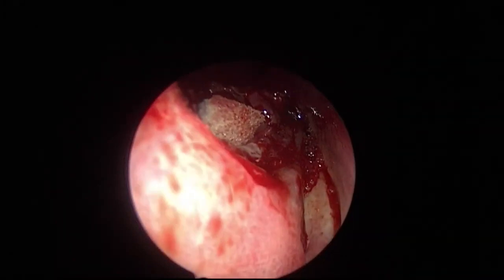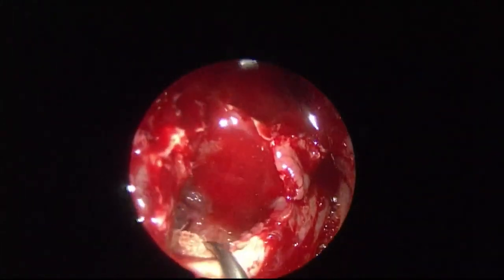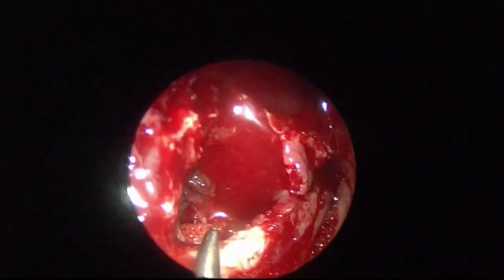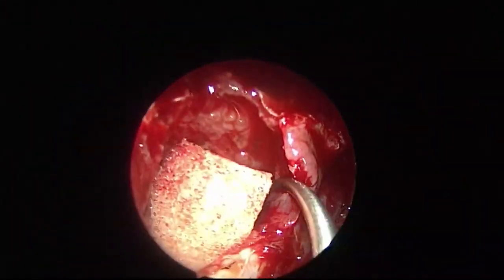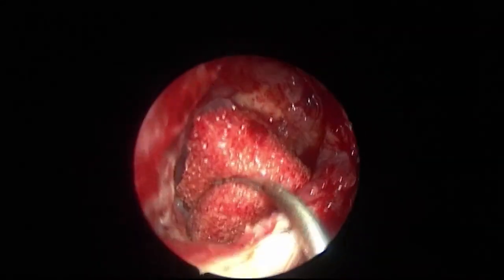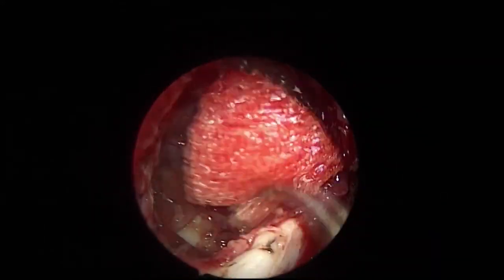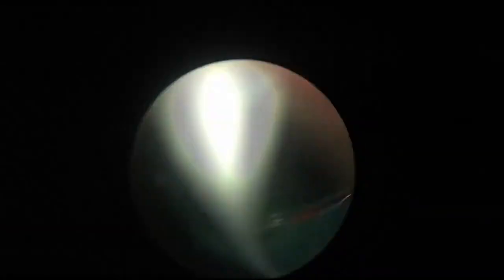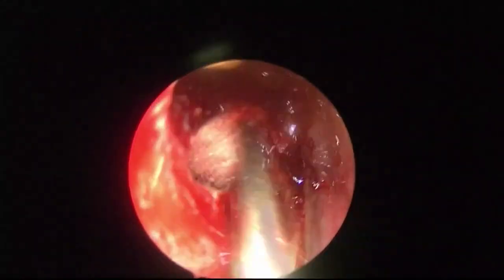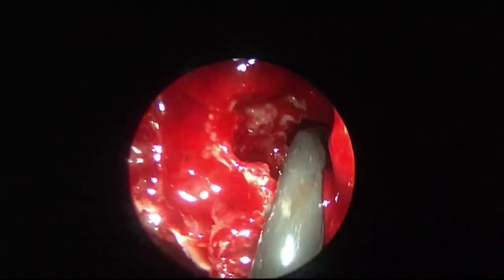There is a question from the audience. Is there a role for a 120 scope? See, again, this hard mopping in this region. See now, even the mucosa are being abraded. Hard mopping. Nothing is left behind. After that, we'll run our hydrodebrider also. Anyway, now we have seen the maxillary. Now go on and see the sphenoid as well.